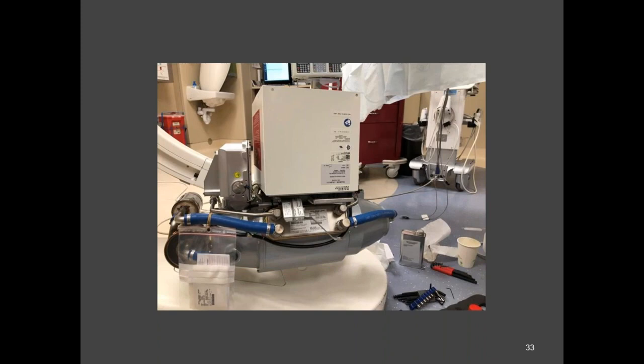So this is what gives you your frame rate for your fluoro. As you're making your run, this will pulse at a rate that the detector can then keep in line with, and it makes for a really nice picture. It also reduces the radiation to the patient, because it's not on the entire time. It's only pulsing at that frame rate to make the image.